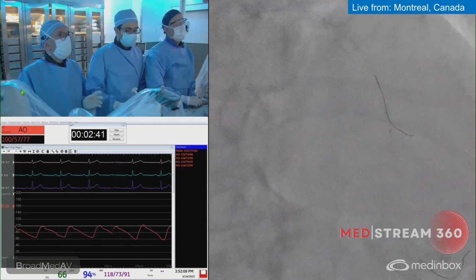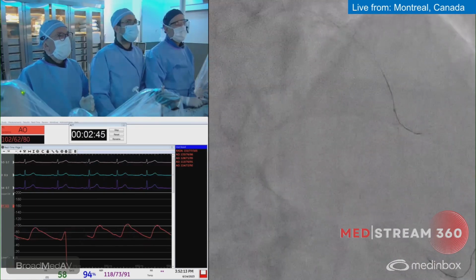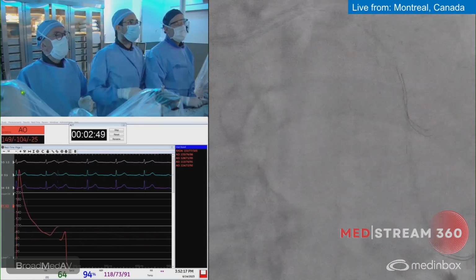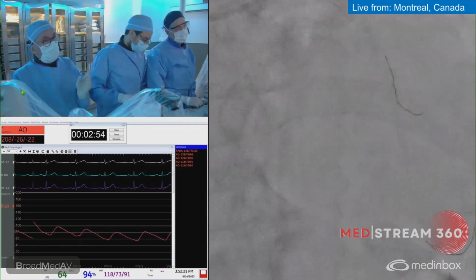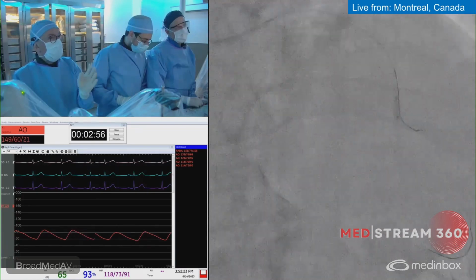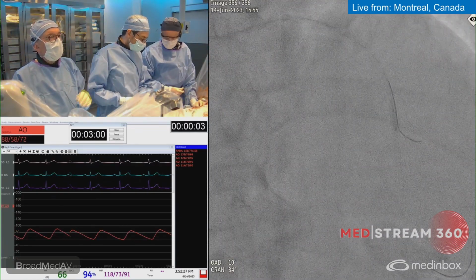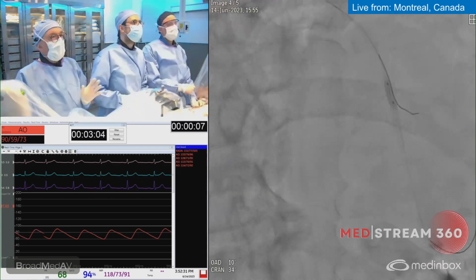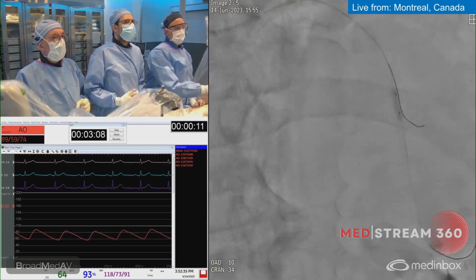Okay, let me see now. Okay, test here. Okay, I can test. Be a bit too far. Yeah, here. Okay. Okay, ready? Yeah. Go. So again, you're right, Guillaume. The wire gives you a landmark. Yeah. I really try to be careful not to go too distal, and it's a Trio, so we can go up. This should open the stent, open the struts to access the diagonal if we need.